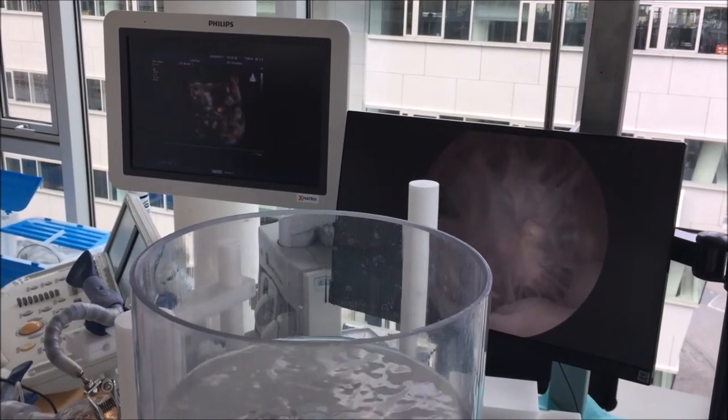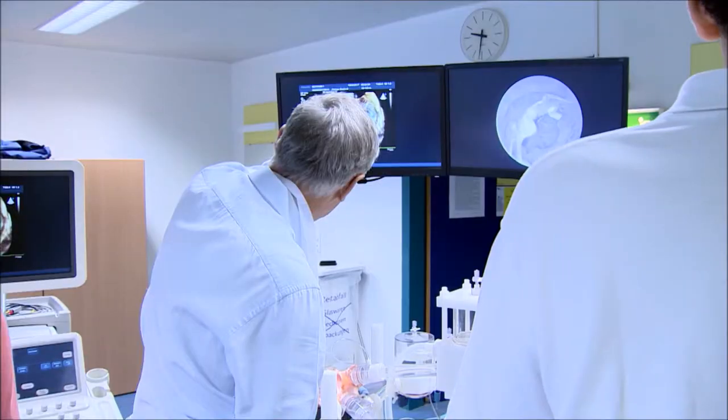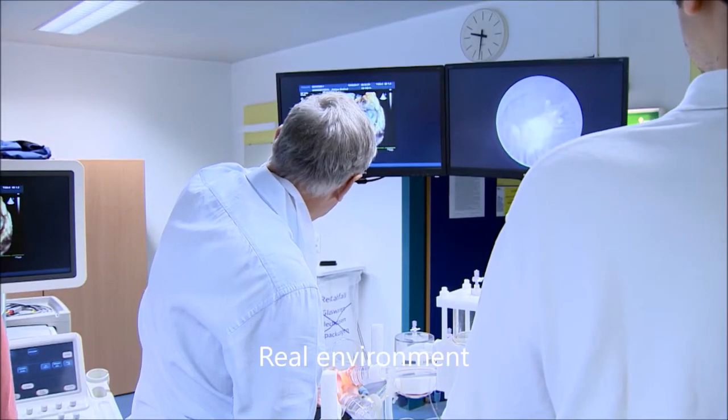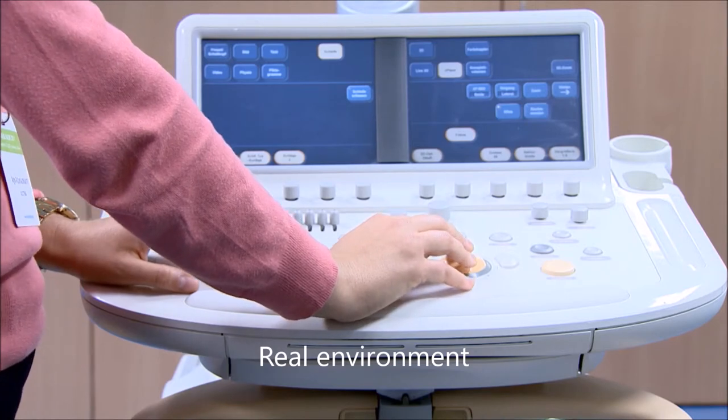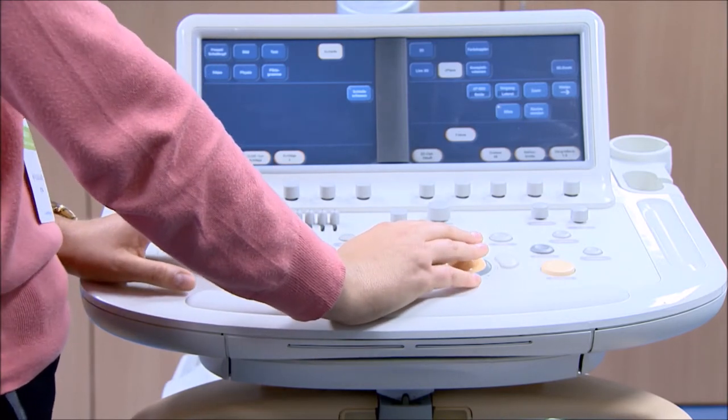You want to work with the knobs here? Crip arms. Definitely. My left hand is the guide, but it's a good guide.